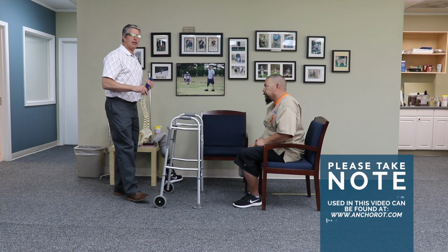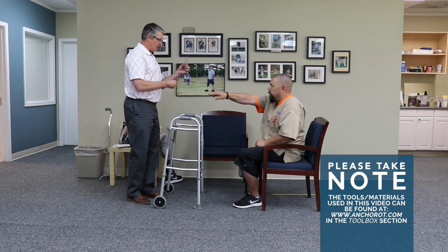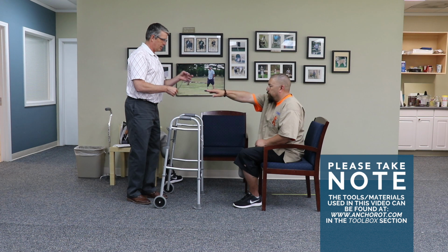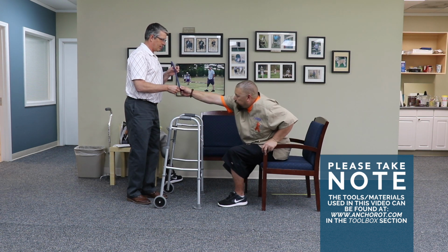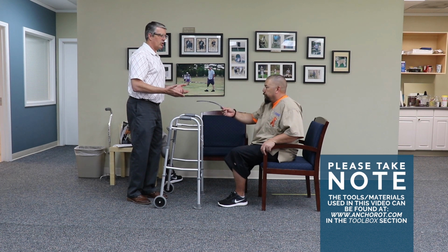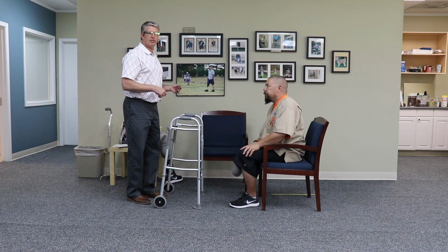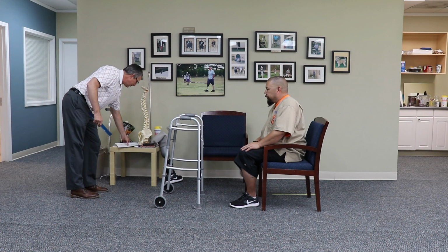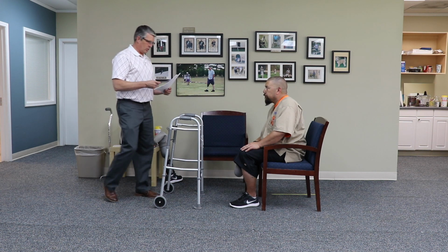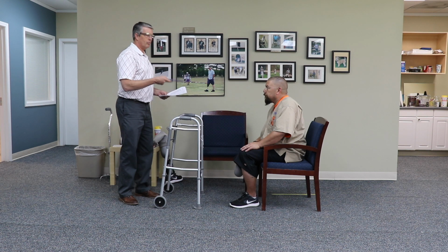Okay, we're going to do this again and show maybe another way where it wouldn't be so successful. So you can reach out, okay, come up, okay. Still needed to use the arm of the chair, had to adjust his position for more balance. Without his prosthesis on, that would knock him down 1 point. Still accomplished it. So again, he was able to do it without any support. That's number 2. The second time around, demonstrated needing some support. That brings him down to a number 1.